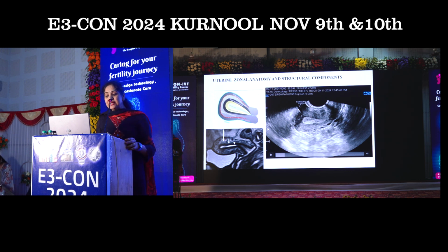And this uterine muscle is divided into two functional units which are delineated even on gross anatomical picture. The inner junctional zone or hypoechoic layer is the thick band of smooth muscle, circular layer tightly woven bordering the endometrial cavity. This is called the myometrial halo or junctional zone, and the outer myometrium is sparse in myometrial density and it appears mildly brighter. So this is the zonal anatomy of the uterus.